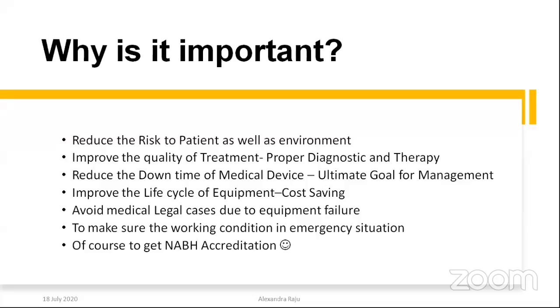So it improves the life cycle of the equipment. If you're maintaining it well, calibrating and using it well, we can even improve the life cycle of the equipment. You can also avoid medical legal cases. If someone criticizes that the medical equipment is not functioning well, we can show the calibration as proof to the doctors or to the patient that our medical devices are functioning well.